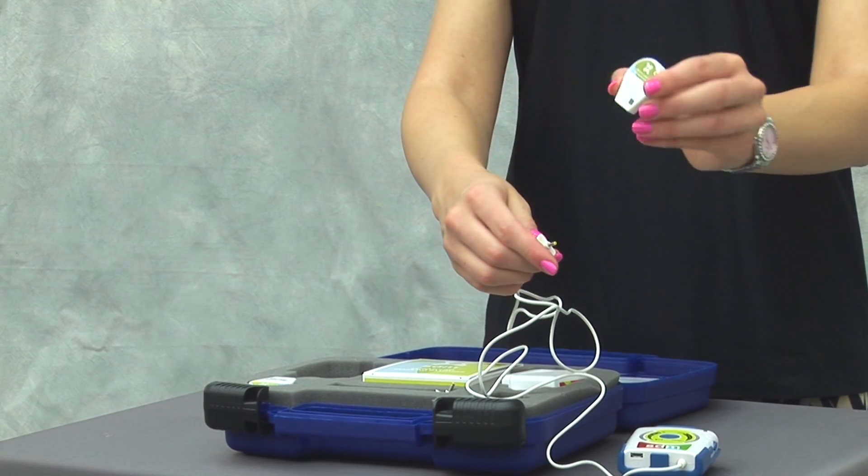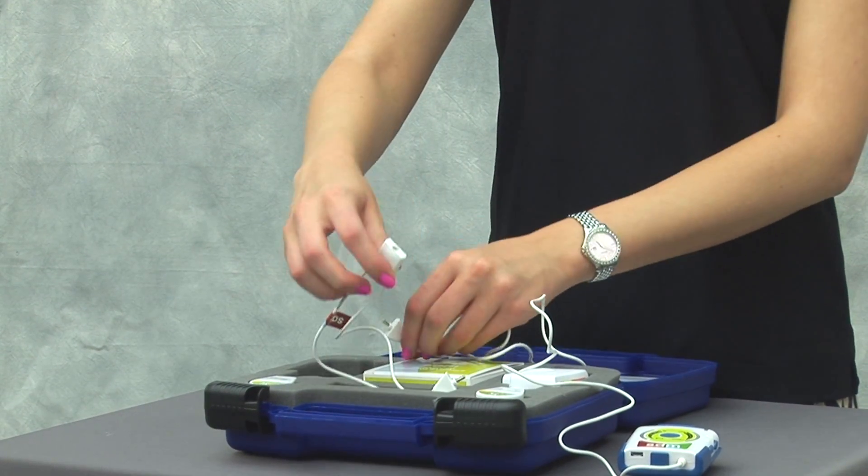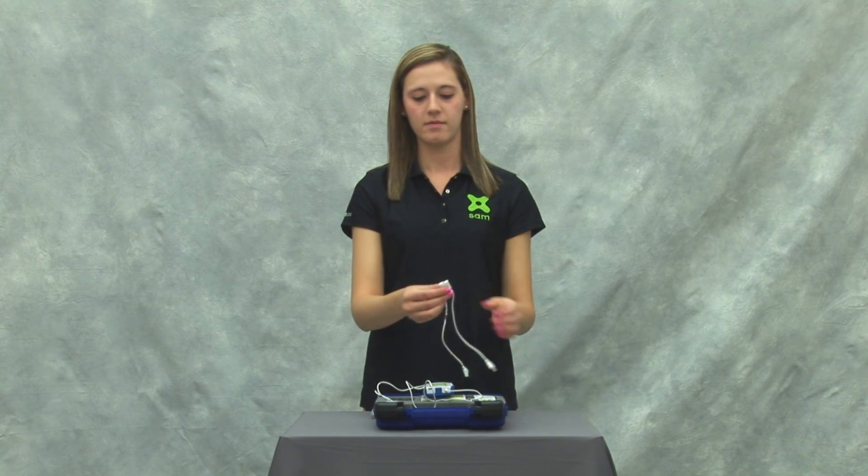Remove the applicator by turning again to a 45 degree angle from the connector and pulling apart. For treatments using two applicators, a Y adapter is included in the kit.